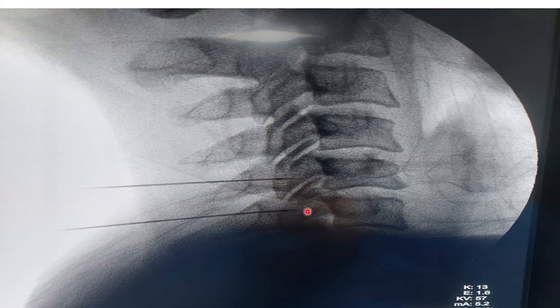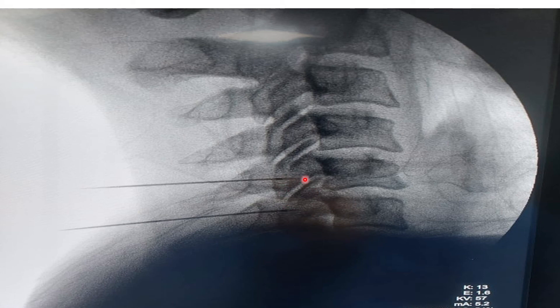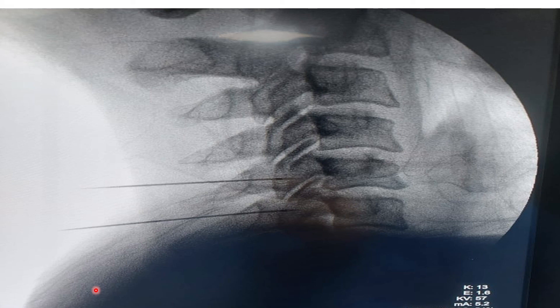My needle is nearly nicely placed. Maybe I can go up two or three millimeters inside, but we can do stimulation first and then think of going inside. One important point: we have to perform sensory and motor stimulation first, and then give local anesthesia — maybe 0.5 ml of 1% lignocaine — before the radiofrequency ablation. If we give lignocaine before stimulation, the stimulation will not come and our purpose will be defeated.